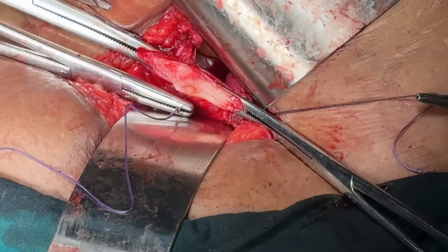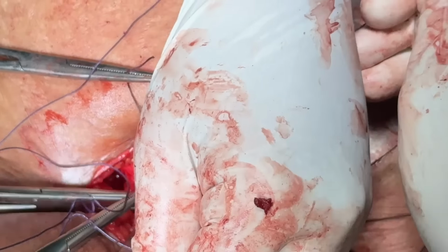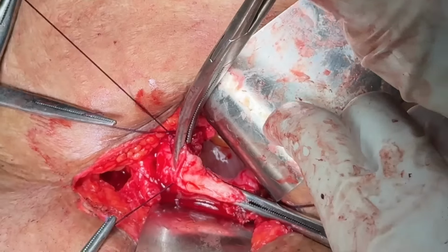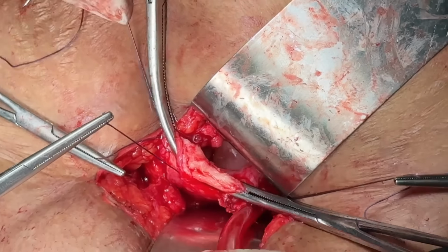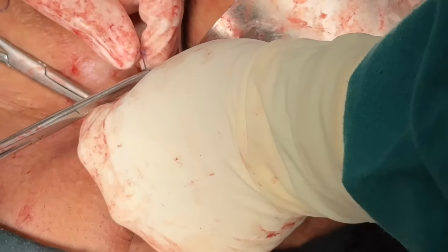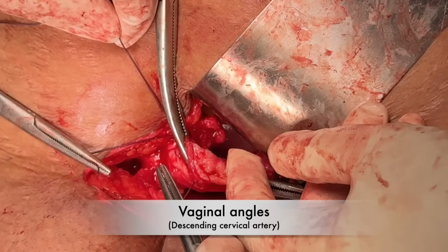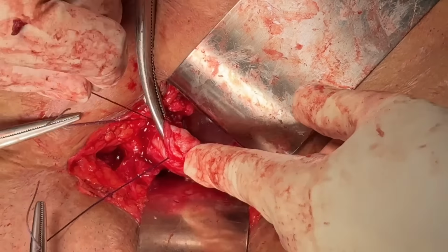After this, first take both the vaginal angles separately. Remember that it has a very important artery, and which artery is that? It is the descending cervical artery. So we transfix on both sides of the vagina, that is the vaginal angle with the artery in it. Take your time, but do it properly.